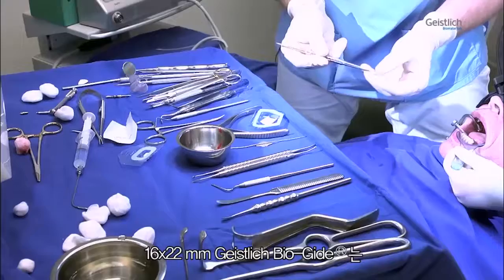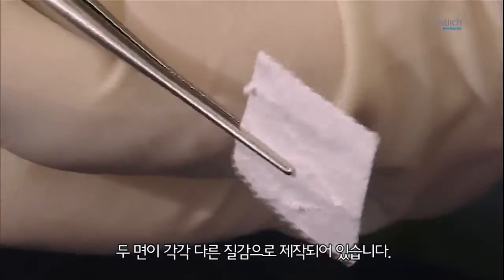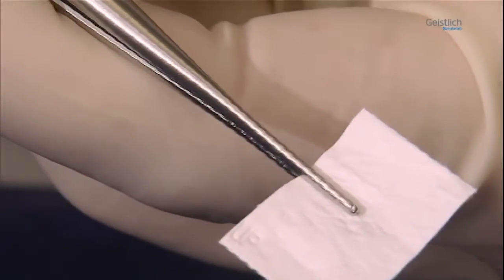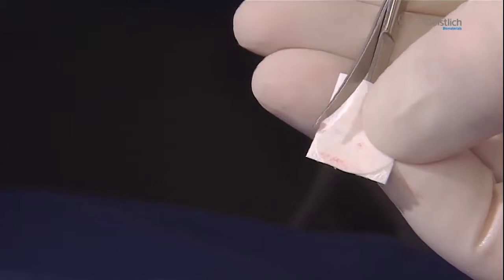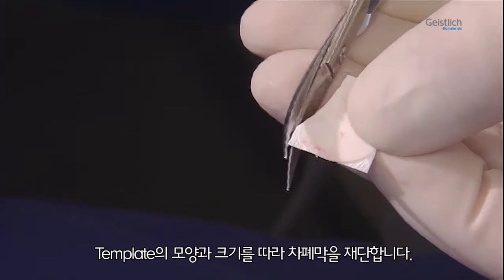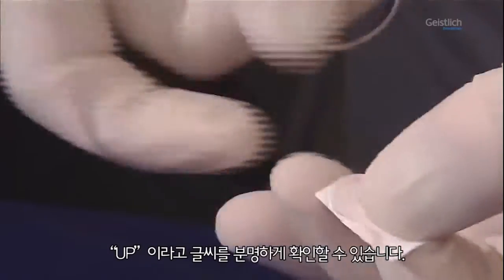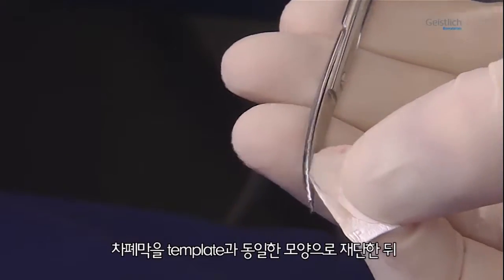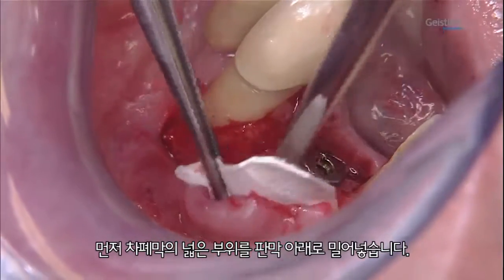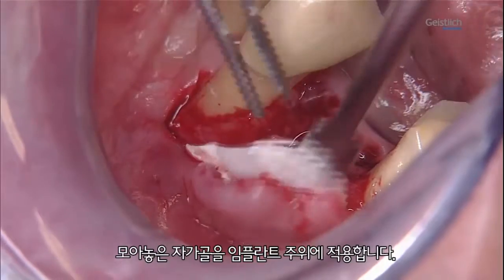The 16 x 22 mm Geistlich BioGuide has two differently textured sides. The outside of the membrane is marked with the embossed word "up." The shape and dimension of the template are now transferred to the membrane. The embossed "up" can be clearly seen here again. Once the membrane has been cut to match the template, its broader base is first pushed under the mucoperiosteal flap. The collected autologous bone is applied in close proximity to the implant.